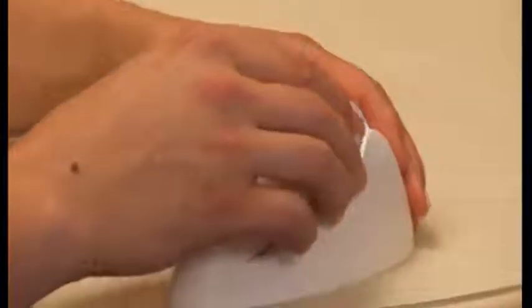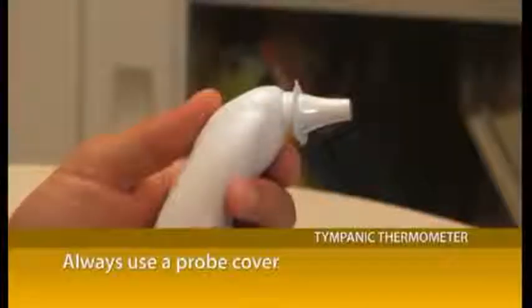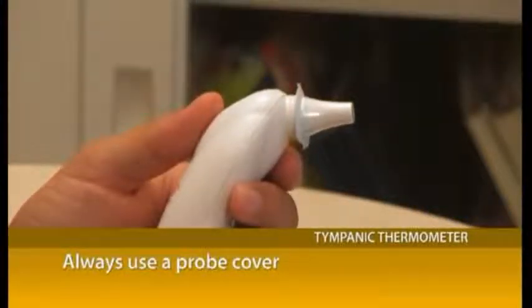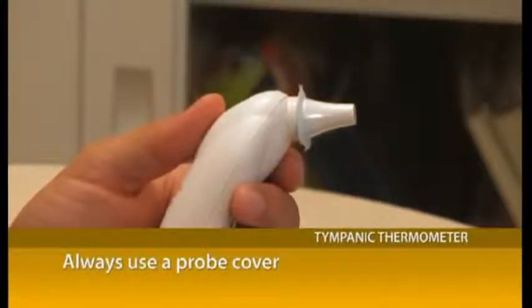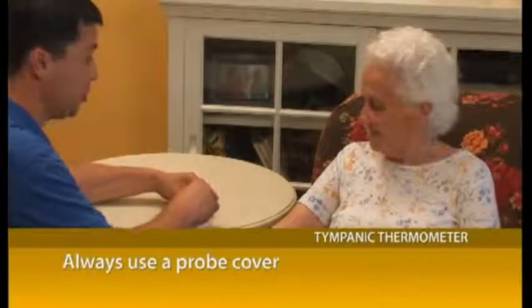There are many kinds of ear thermometers. Carefully read the instructions before using your thermometer and always follow manufacturer's instructions. Take the thermometer out of its holder. Put a throwaway cover over the tip of the thermometer. Instruct the resident not to move her head.